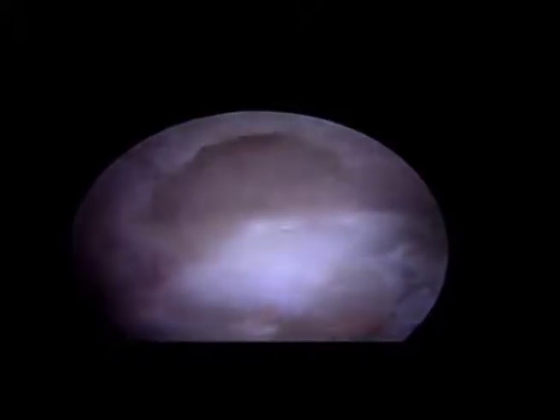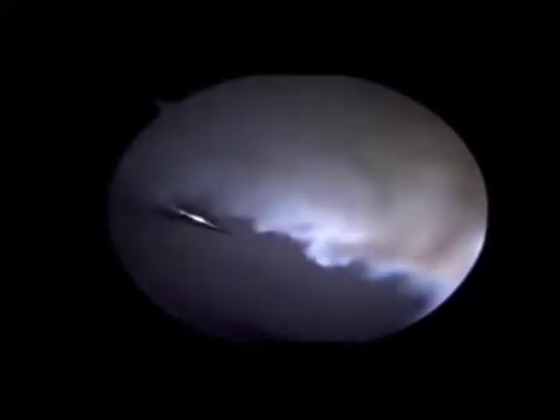Finally, a thermal device is used to ablate the lesion, again being mindful of the proximity to articular cartilage. After adequate lesion removal, AIIS decompression, and rim resection, the labrum is repaired using PEEK suture anchors.